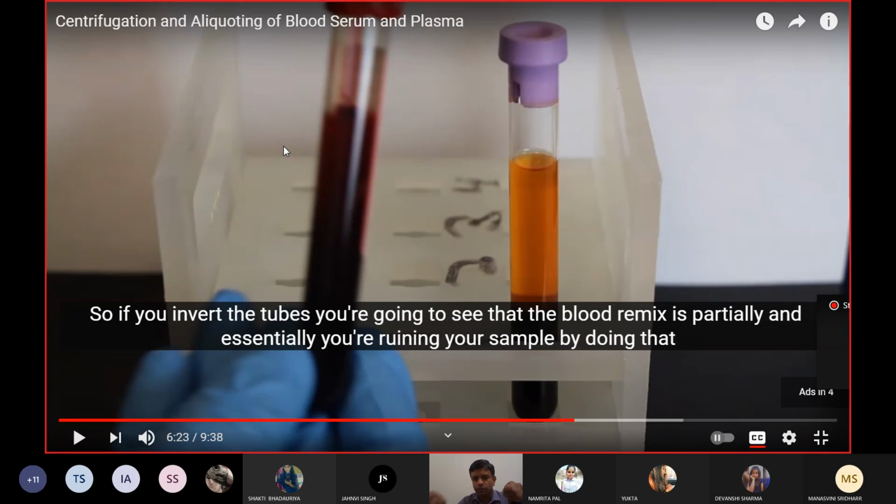Okay, because he has already shown you, if it gets mixed, then you can see the serum here is not yellow now, okay, and all the blood or the blood components, it has mixed with the serum, right? So for diagnostic purpose you cannot use this kind of sample, right? Sometimes what happens, when you are working in a lab and you get these kind of samples, those samples are rejected, okay. People will not put these kind of samples in their machines, right?